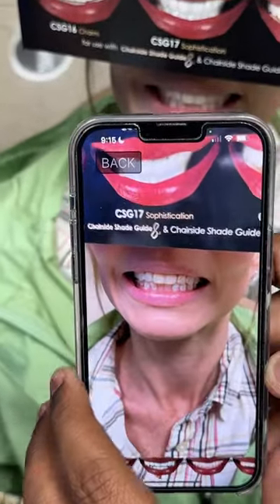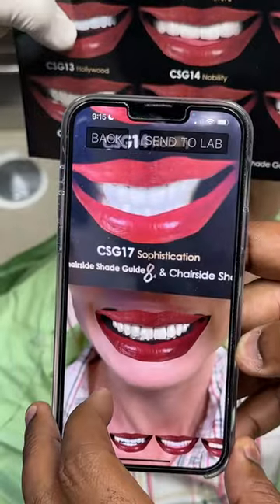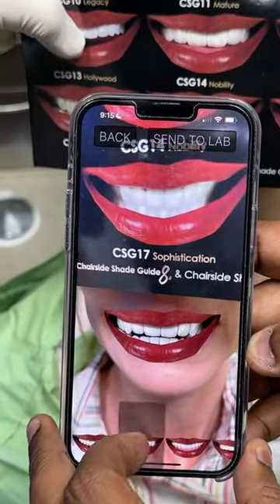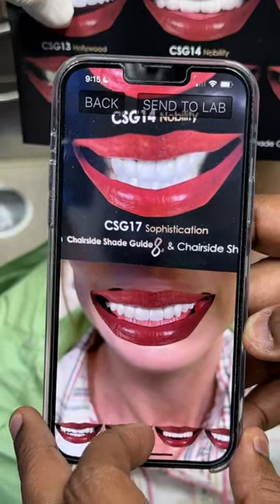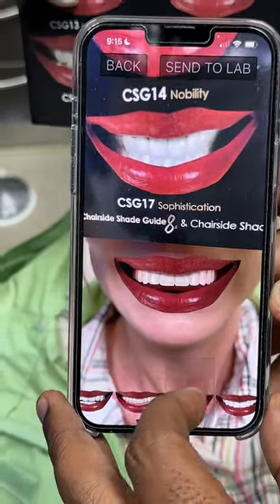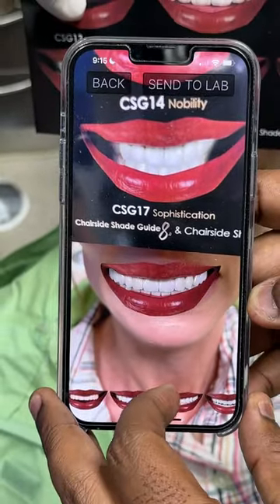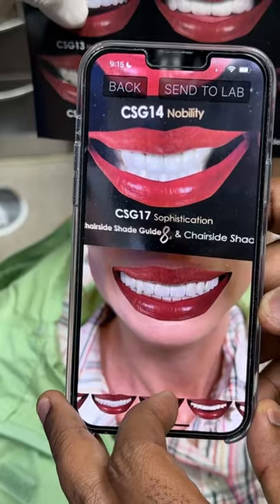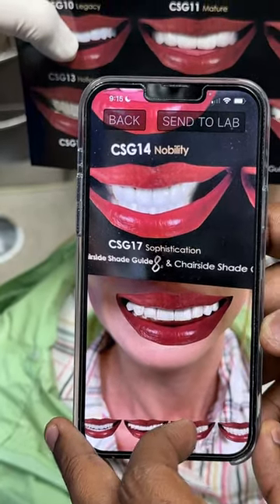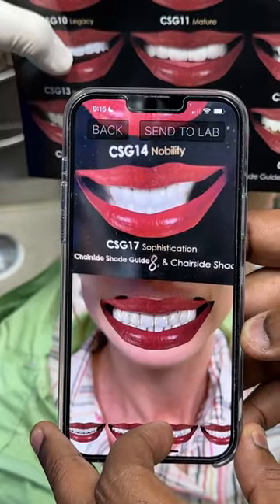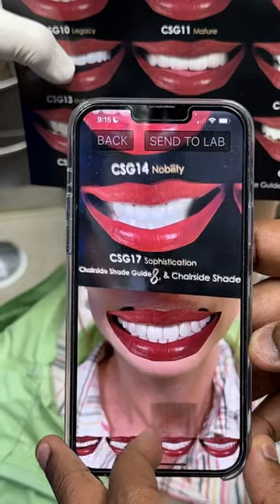Not only color matching, but also choosing the shape of the tooth. This is my selection app, so we can see the shape and size and communicate with the doctors, the patient, and the laboratory.